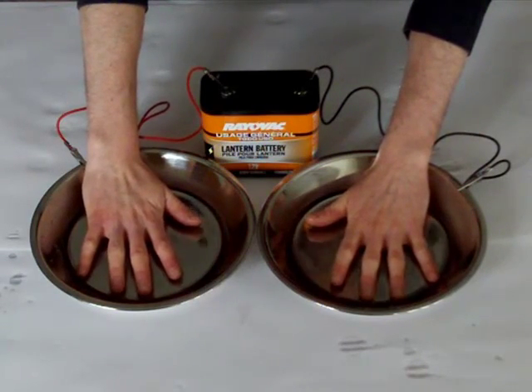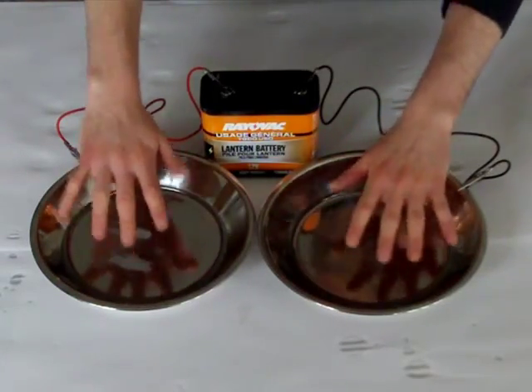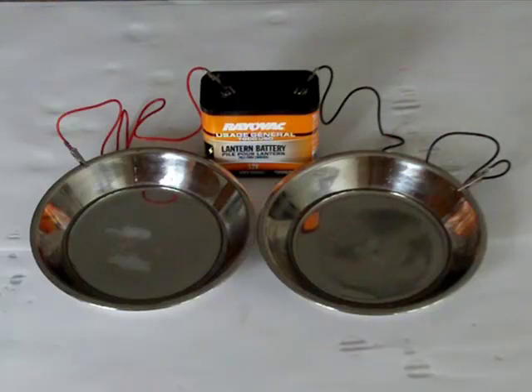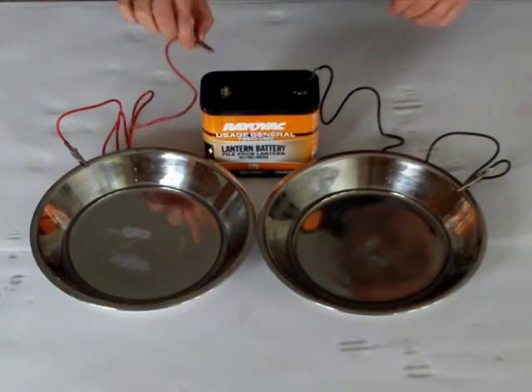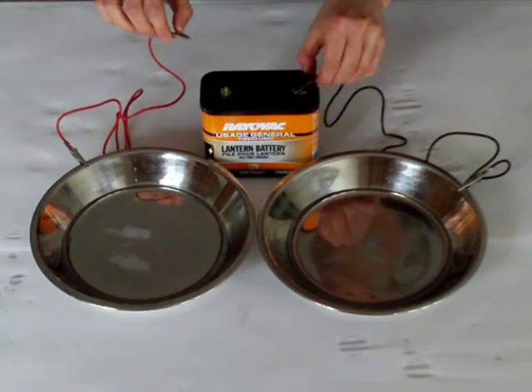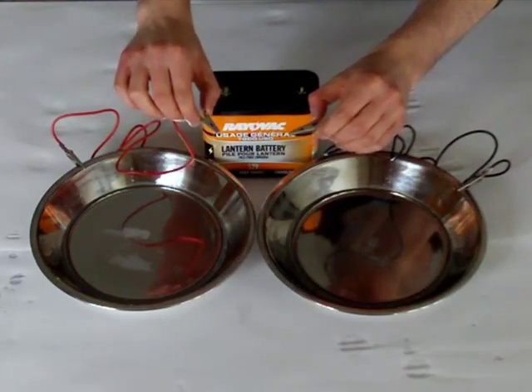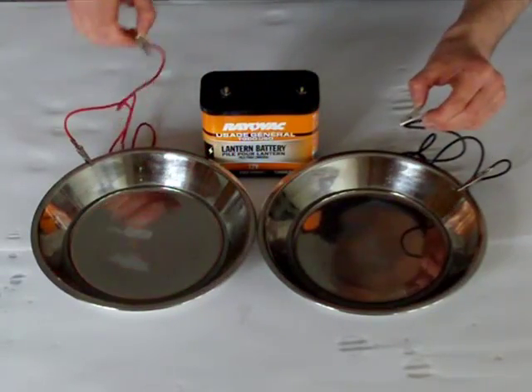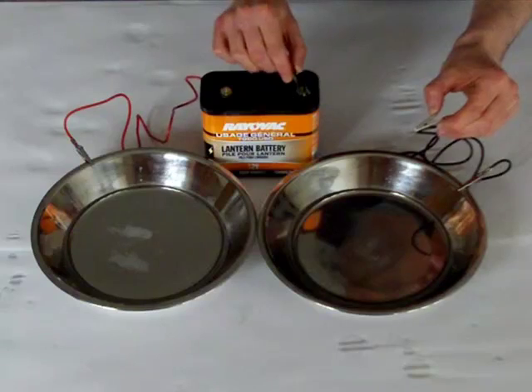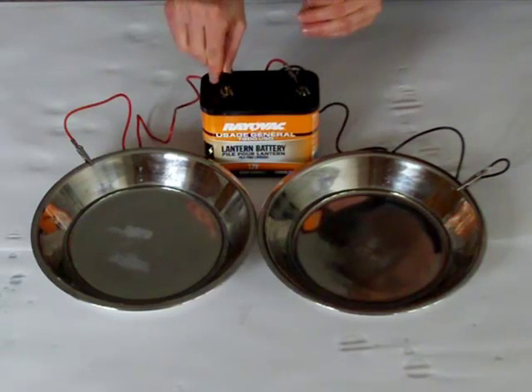Through the magic of video editing, it's 10 minutes later. Now we're going to reverse the polarity of the charge. Remember, never touch the alligator clips together while they're still attached to the battery — they can spark, and it's not good for the battery. The charge is now reversed, and we're going to submerge our hands again for another 10 minutes.